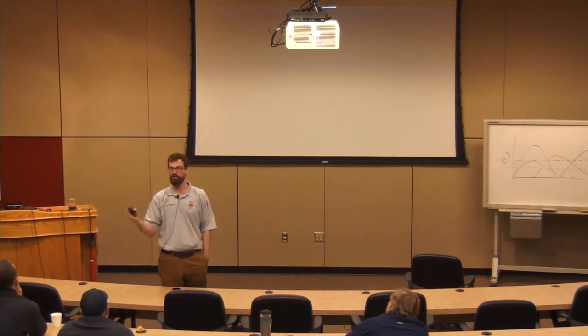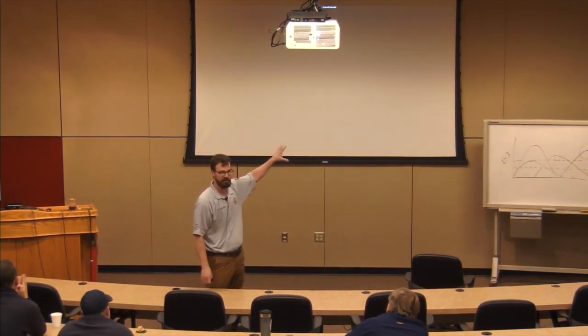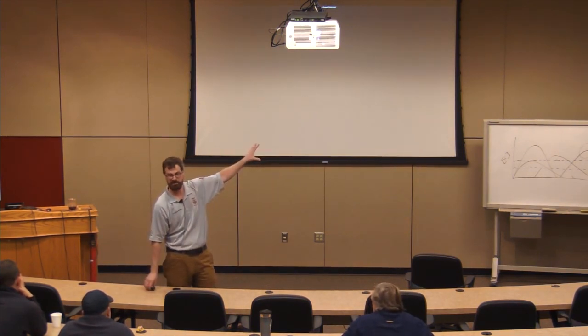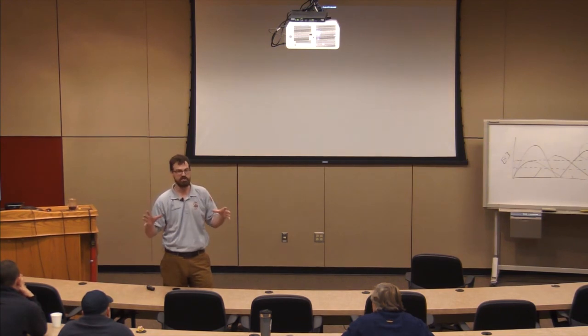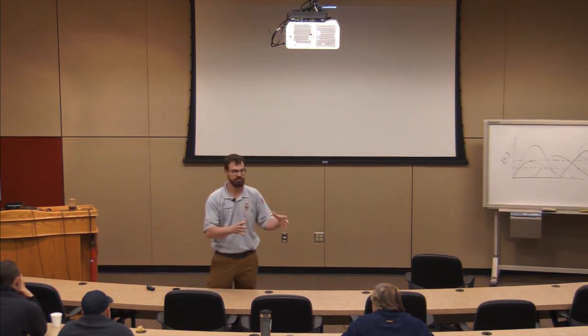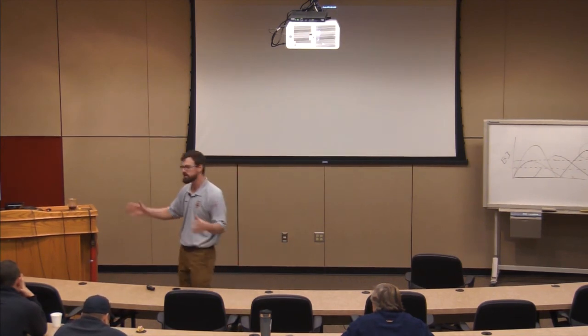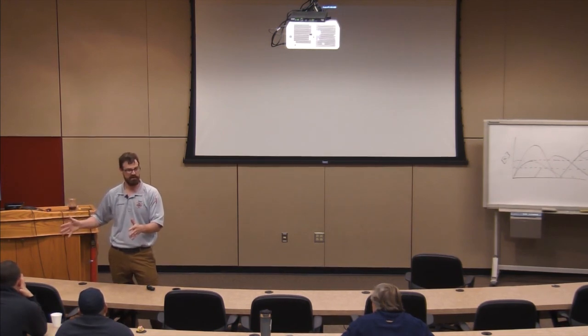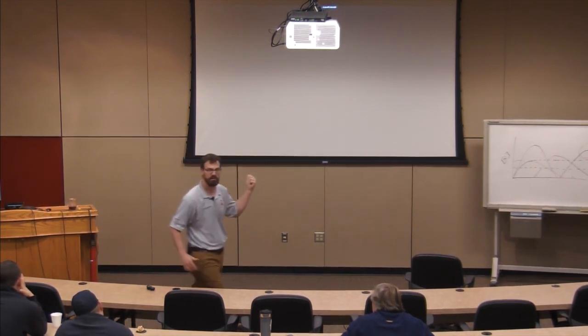So the moral of the story is you don't have to remember everything that's up here, right? We covered a crap load of material. The whole purpose of this is to introduce you to using the EKG in the setting of overdose as a diagnostic tool. We use the EKG all the time in chest pain as a diagnostic tool. And when I use it in the chest pain patient, I'm looking at ST segments, right? I'm looking for ischemia. I can take this fantastic tool and use it in the overdose setting to identify potential cardiotoxic drugs. There's a lot of cardiotoxic drugs in the community.